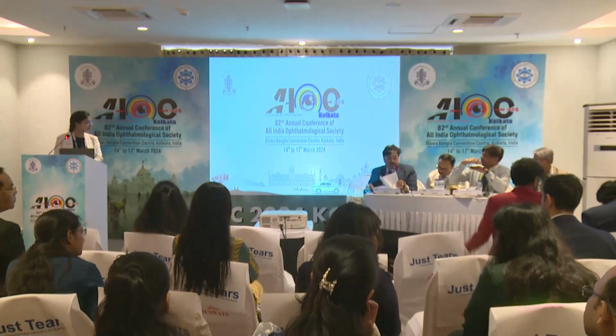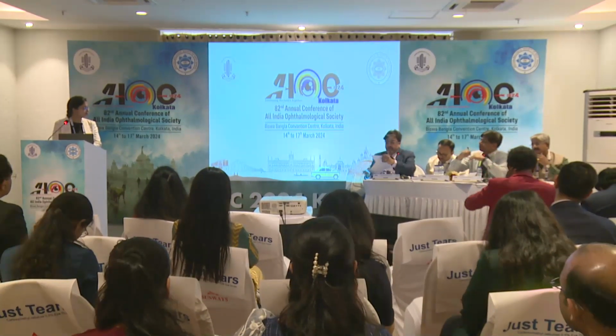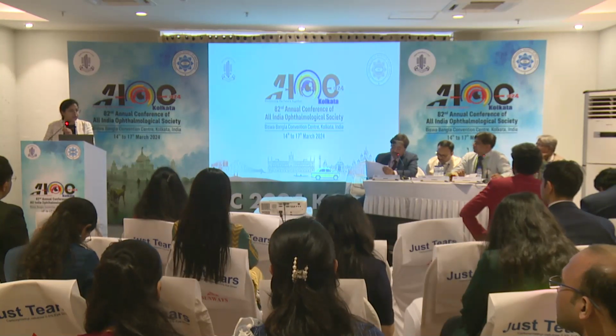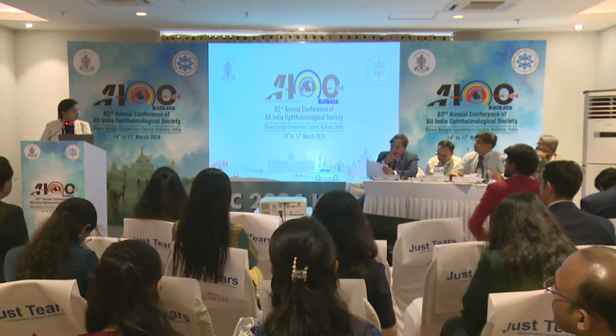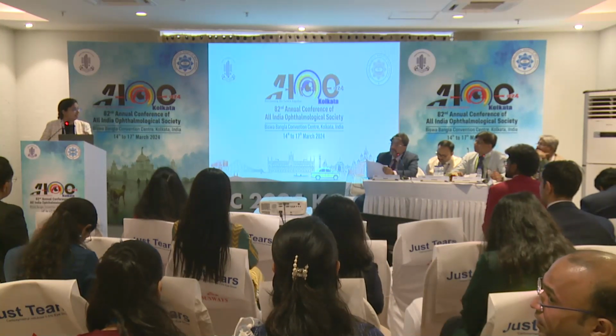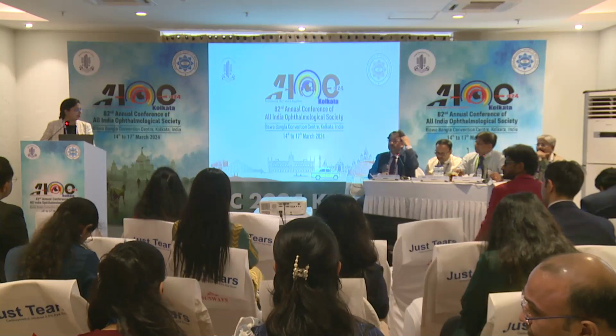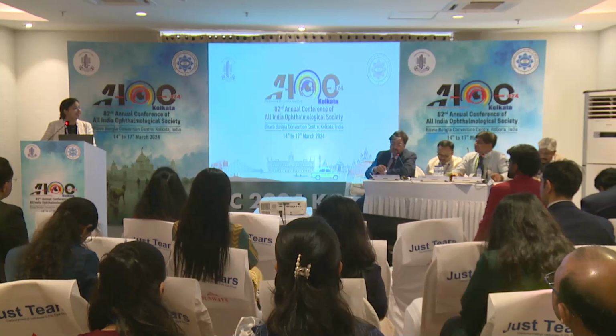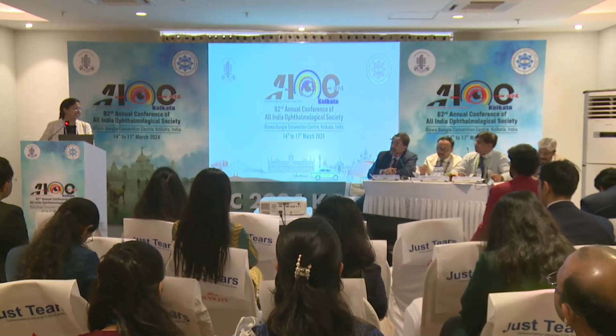Nice presentation. Is there any way with the anterior segment OCT that you are differentiating between fluid and the viscoelastic if it's between the two layers? So to differentiate between fluid and viscoelastic is not really possible in ASOCT. Sometimes you may see hyperreflective spots if the viscoelastic is not a cohesive one or has some imperfections in itself. Otherwise, it's difficult. Yes. Okay. Thank you so much.